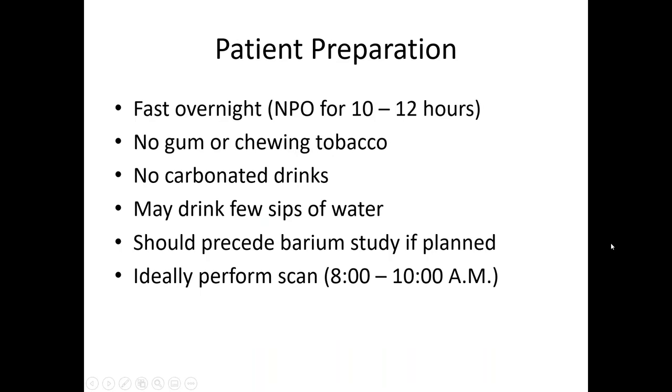When you perform the scan, you have the patient fast overnight so that you can get an unobstructed view, preferably, of the abdominal aorta. If you're planning a barium study, definitely proceed with the ultrasound first, because you don't want the patient to swallow barium, as that can obstruct the view. An ideal time to scan would be early morning. Of course, if the patient comes in an emergency setting, we can definitely perform the ultrasound anytime.